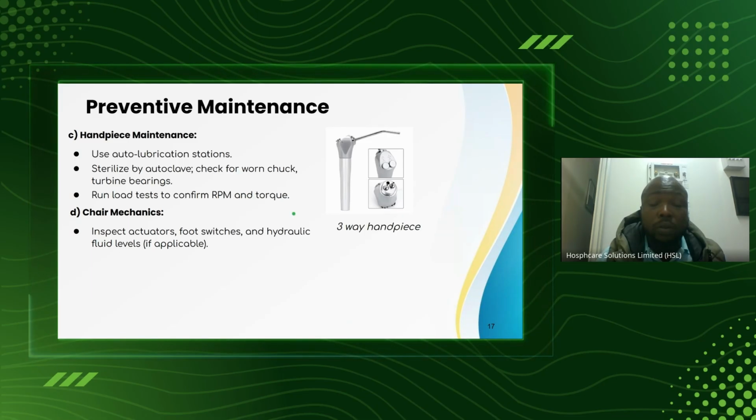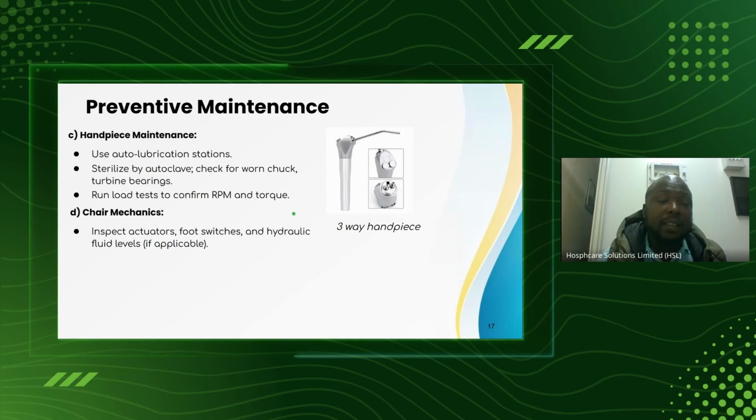And also, you lubricate with a clear oil, but that's one you do only when you hear mechanical noise. Otherwise, they are very effective and don't require to be tampered with.